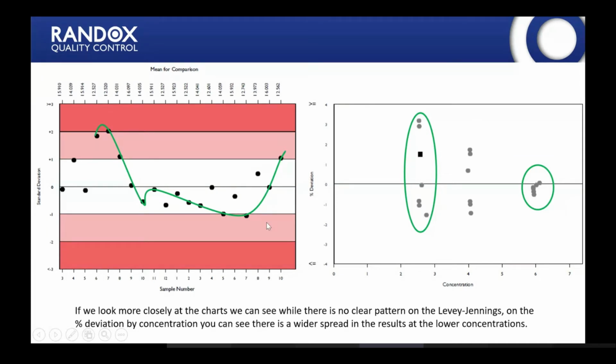So the results are all within acceptable limits. They're all within the 2 standard deviations here. But the lab just need to monitor that lower concentration level and see if there's anything they want to do, whether they want to add another lower level control to try and improve the performance here.